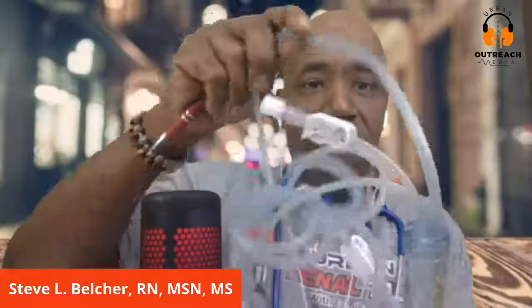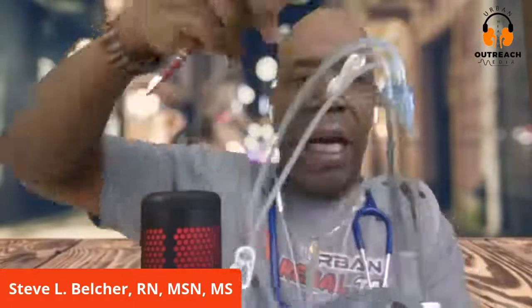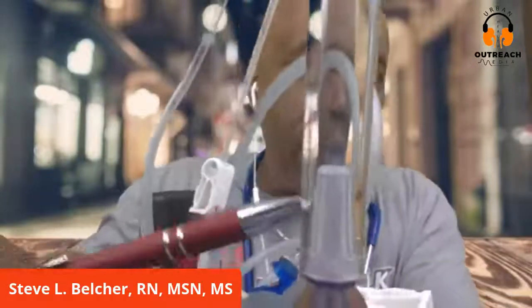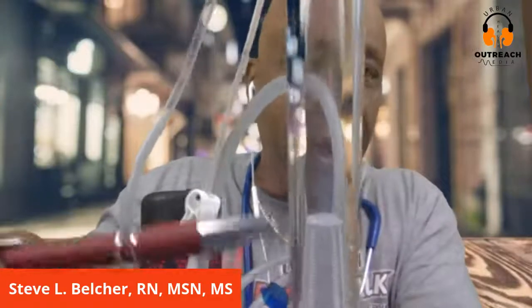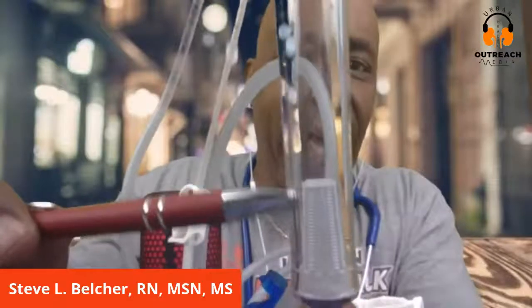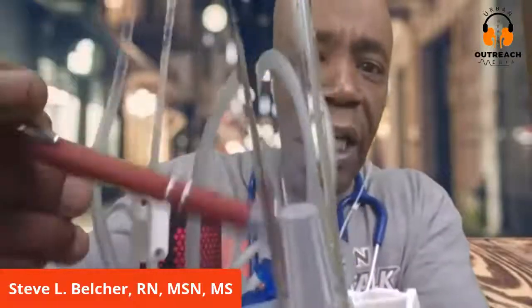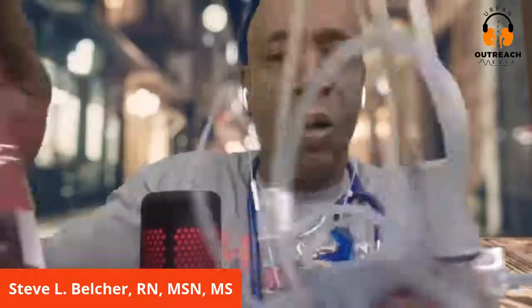This is the venous trap on the venous line. And as you can see, this is where the blood comes down into the venous chamber. Now, you can see this filter right here. This is what they're talking about. This is supposed to get air out, but if it's a lot of air and it gets through this point right here and it goes down, that's when the machine goes off.